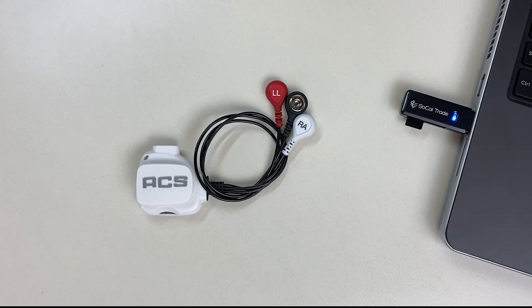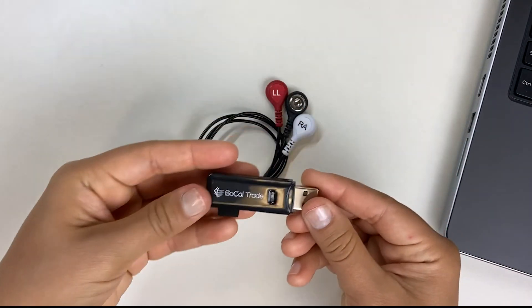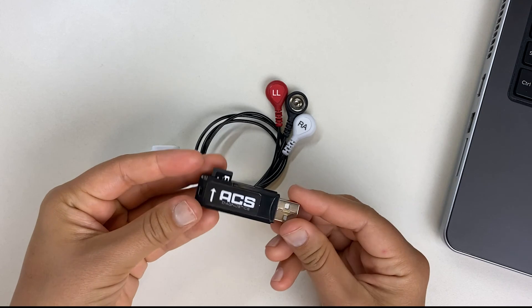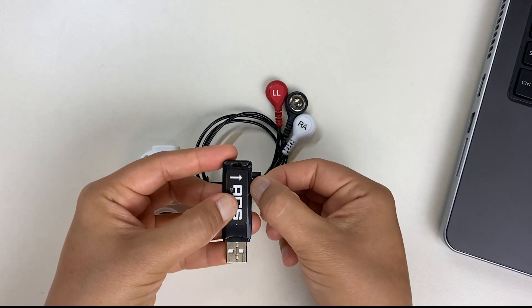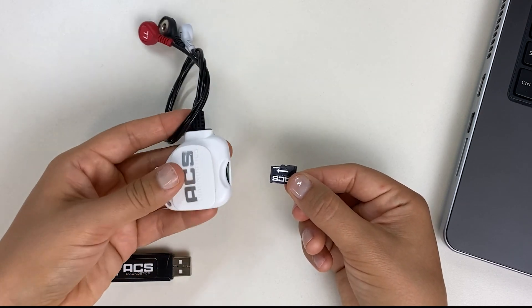Next, remove the memory card from the USB card reader. To start the test, insert the memory card into the clip device. The memory card must be pushed fully into the device so that you hear a click.